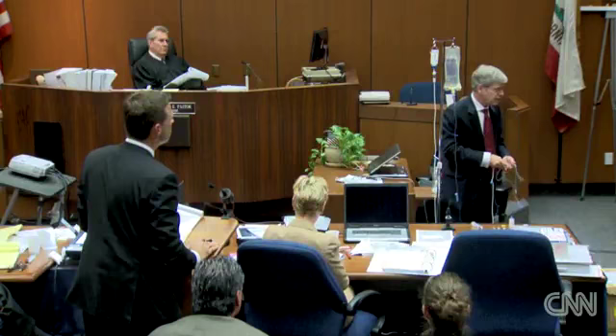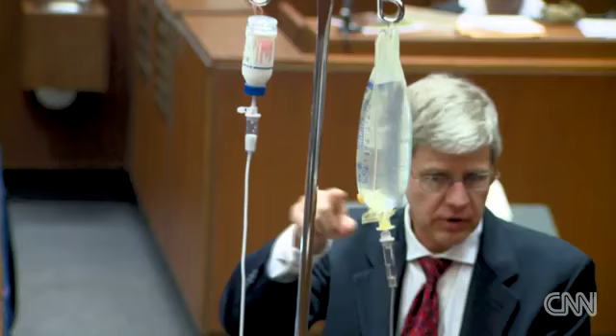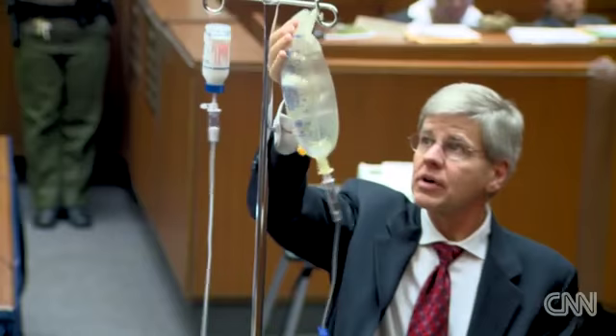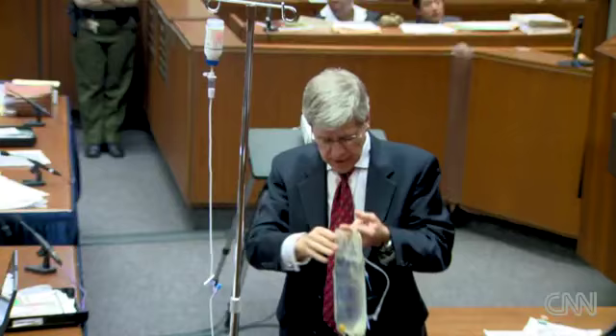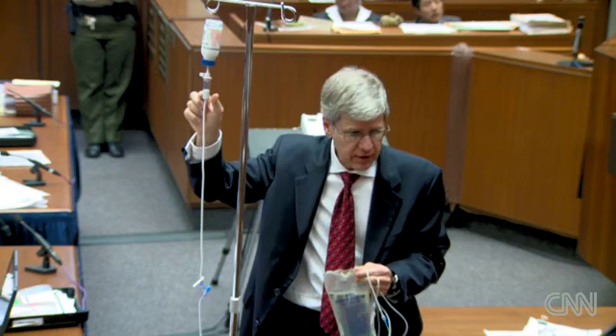This is an extremely unsafe setup because gravity is responsible for driving both of these lines, and they are competing with each other for gravity. If I raise this up quite high, there's more force here and this rate will slow down. If I drop this down, there's more force here and it will speed up. If the saline bag is turned off, this will speed up quite a bit because there's no pump controlling the rate — you're dependent on gravity.